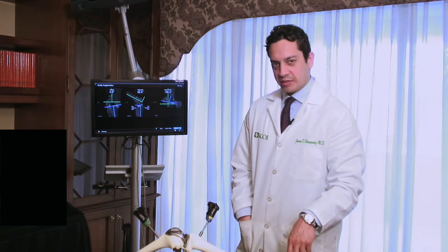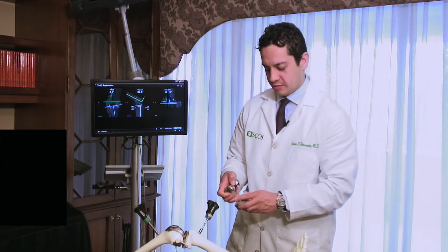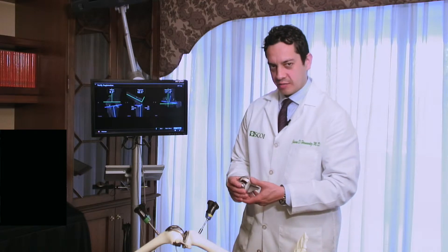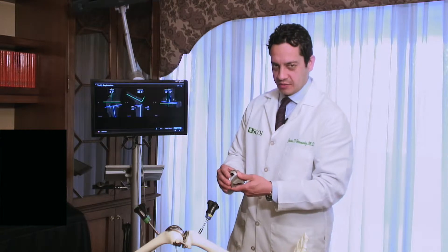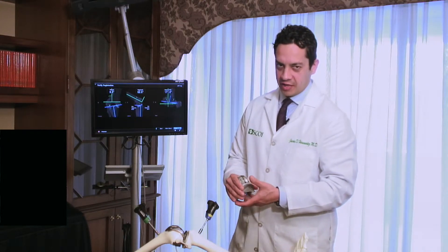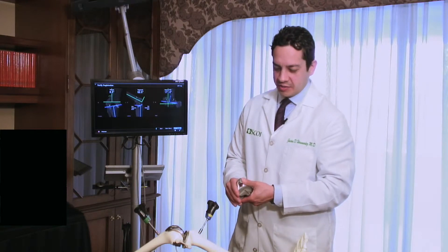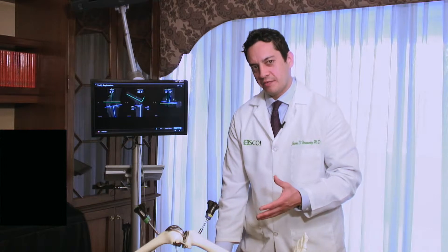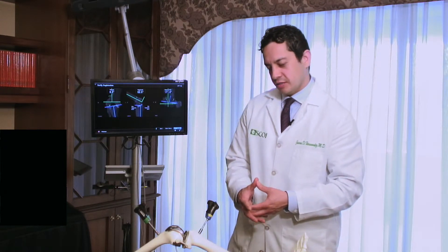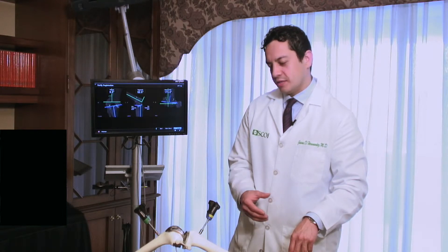This is a computer-navigated knee replacement. The computer has been shown to improve alignment in knee replacement — one of the surgeon's key jobs. The real benefit of the computer is that it's a very accurate measurement tool, giving me confidence that the parts are perfectly aligned. It's also a benefit to the patient because older methods using rods inserted into the bones can cause bleeding. With this computer, alignment is more accurate and less invasive for the patient.